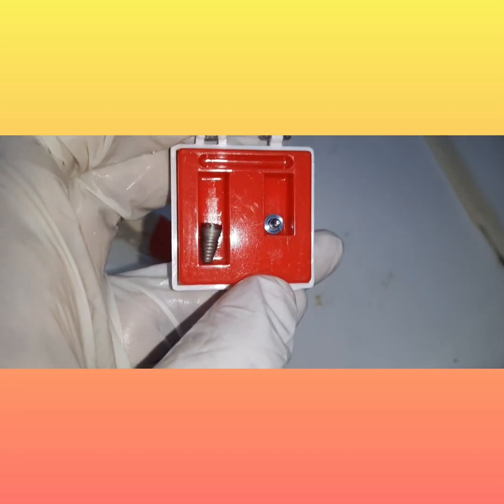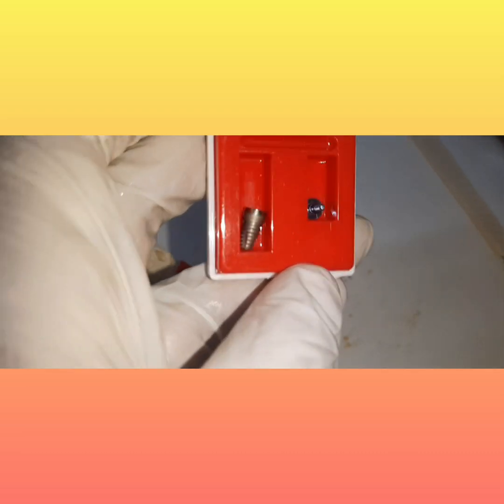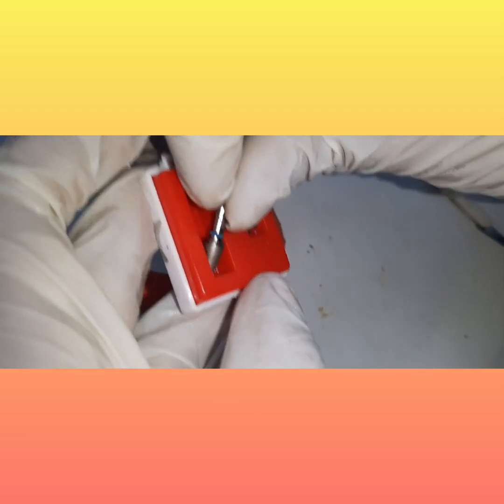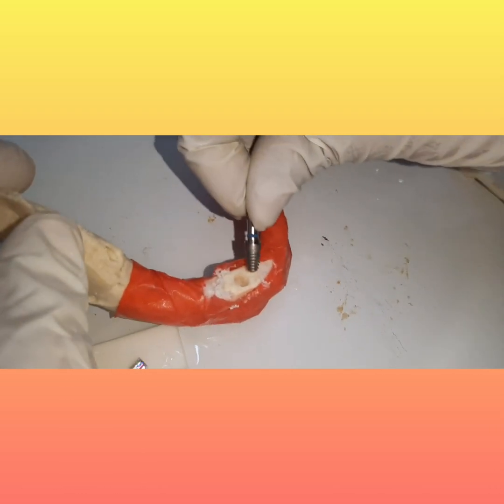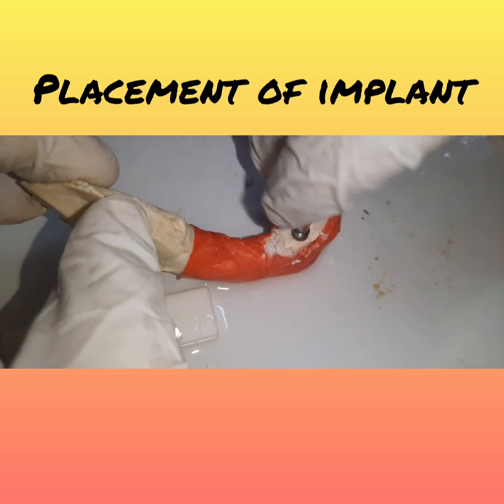You'll be using the implant driver. You're going to pick up the implant using the driver like this very carefully, and you'll be taking this to the surgical site and just holding this in there and tightening with your hand first like this.